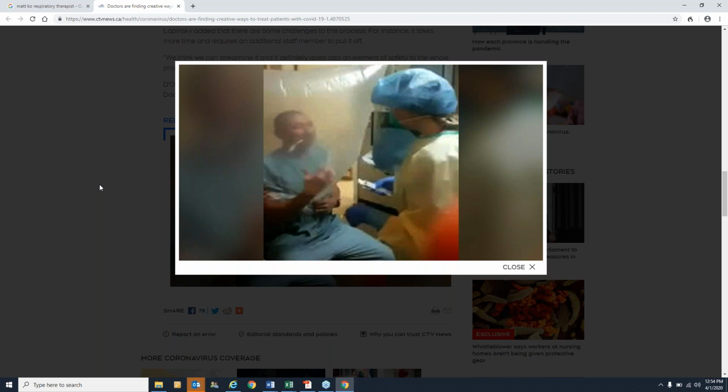And then we extubated the patient, sort of tucked the bag around him, hanging onto the ETT. And with our one patient that we did extubate this way, he did cough, gave up 2 large coughs, and we hope that that was captured in the bag. And then we slowly gathered the bag around him, hanging onto the ETT. And again, we're theorizing that we captured any aerosol into the bag.